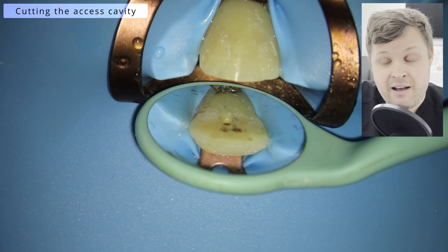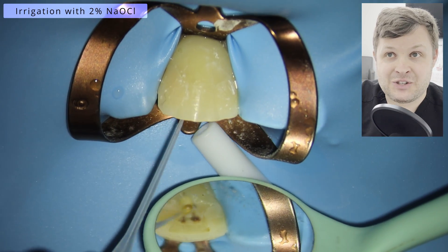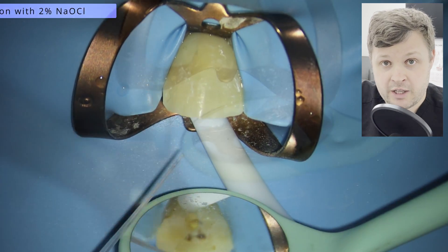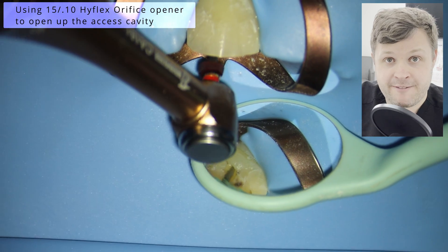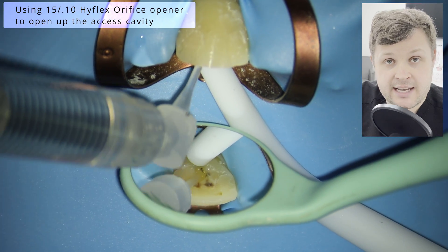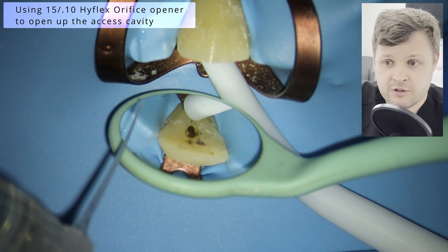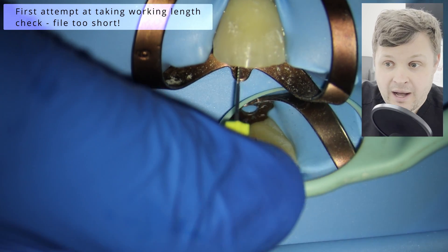We're going to do a nice minimal access here. You've got to be really careful with incisor teeth that you don't orientate your bur the wrong way and go out the buccal side. Just make sure you're orientating your fast handpiece bur correctly. Unusually in this case I'm just using an orifice opener to open up the access cavity — I don't often do this.